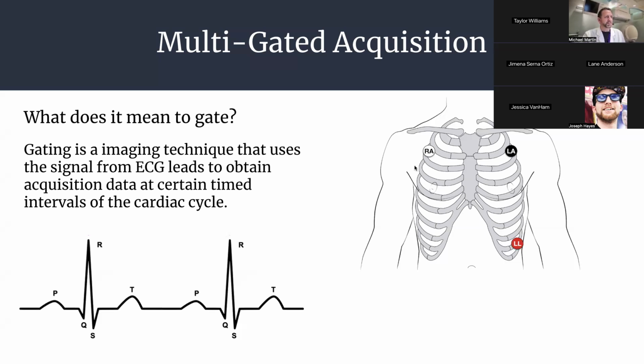So what does that mean? It means when we set up our patient for a MUGA scan, we're going to set up with a 3-lead EKG. Most cameras are going to have your lower left, your left arm, and your right arm usually in that configuration. I have seen some cameras that have a 4-lead, but you're generally going to be set up like this. Look at the ends of your leads, because they'll probably tell you where they need to be. And we'll talk about some variation on that, possibly, especially when we talk about stress testing. But that's your general setup.